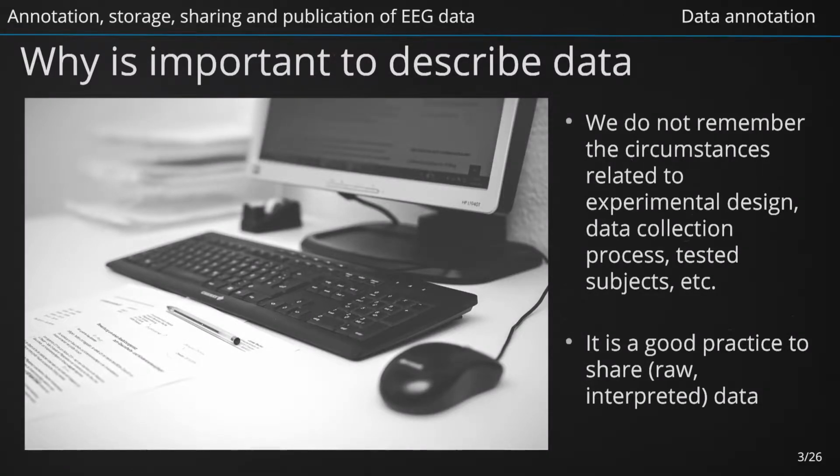Such annotation has to be clearly understandable not only to the experimenter who has collected the data, but also to other scientists, analysts, or data users, and has to be clearly understandable not only now when the experimenter knows and remembers the circumstances related to data collecting, but will be understandable also in the future. Data and their annotation are thus very important for correct data representation and, of course, their current and future understanding and interpretation.